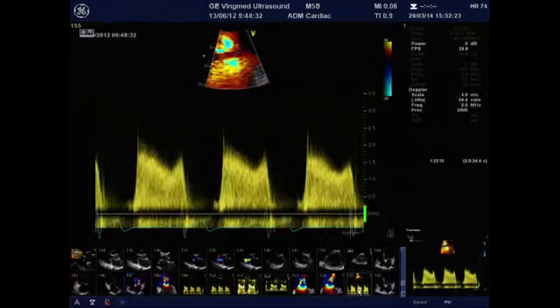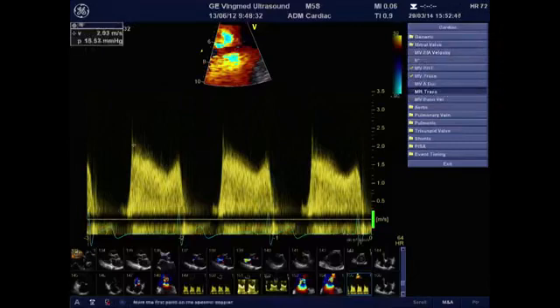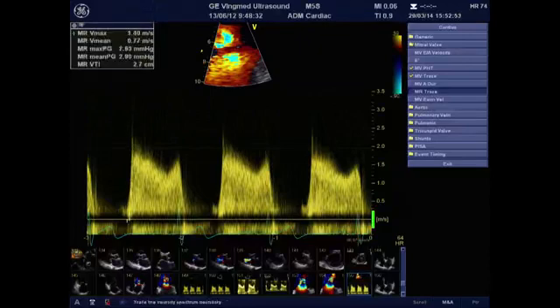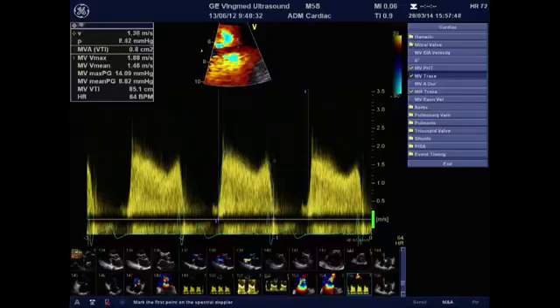And here is the tracing that I've got, in which you see the velocities, all velocities across diastole, which will enable me the calculation of the mean and the peak gradient. As you know, the peak gradient is related to the peak velocity through the Bernoulli equation, while the mean gradient is assessed by averaging the instantaneous pressure gradient during diastole, from the beginning of diastole to end diastole. So you were well aligned with the flow and you put your continuous Doppler on and you have such a flow. And actually by doing the tracing, you'll be measuring the mean and the peak gradient.